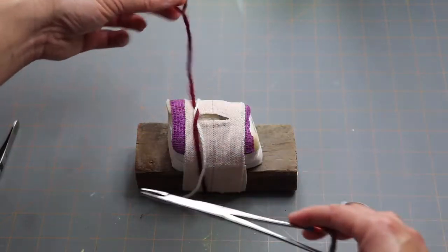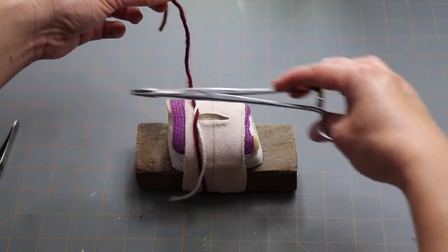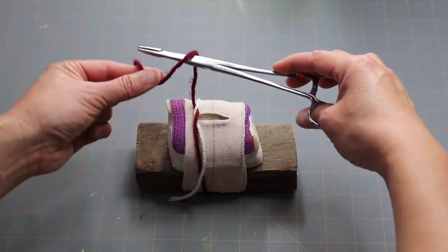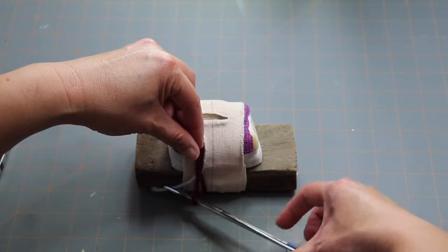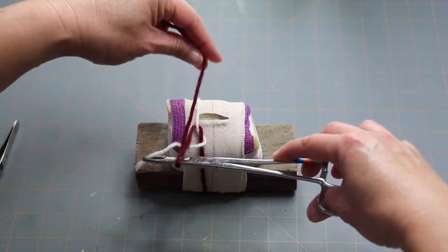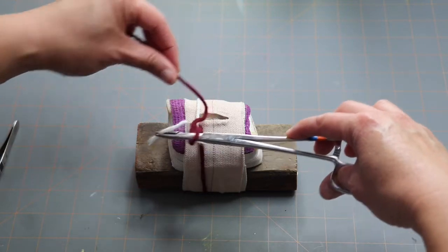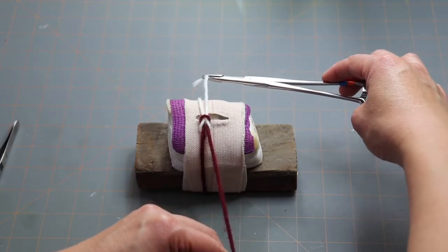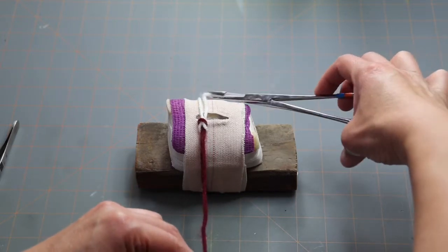Throw number two starts the same way. Your non-dominant hand still holds the maroon suture, and your needle holders stay inside over the incision area. Wrap your maroon suture over your needle holders, come down and pick up the end of the white suture. Pull your hands opposite — the hand holding the maroon suture moves towards you, the hand holding the white one moves away. Pull your suture. See how that knot looks? That's how a proper square knot should look — no extra loops. That's throw number two.